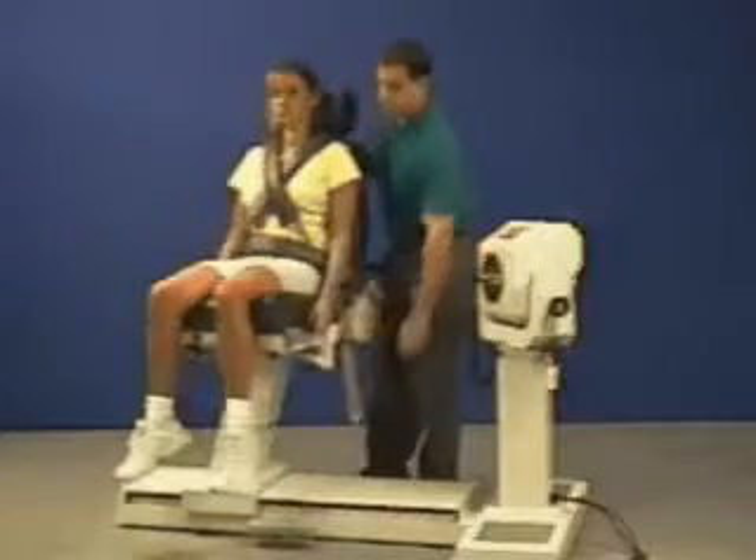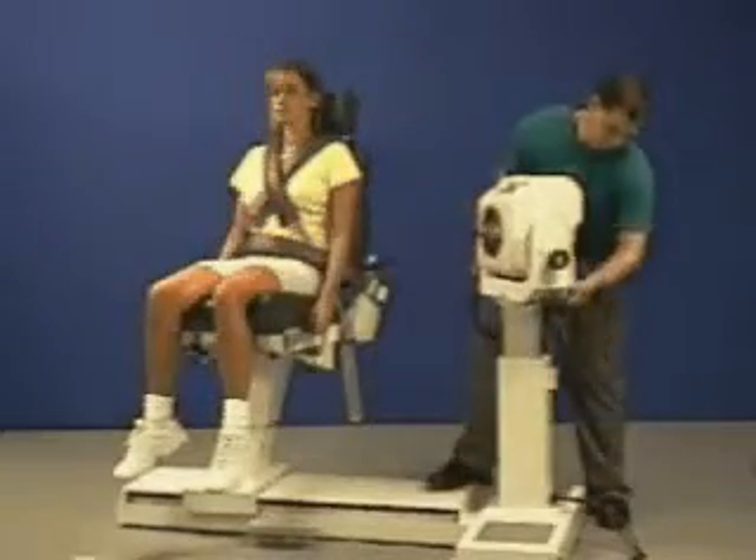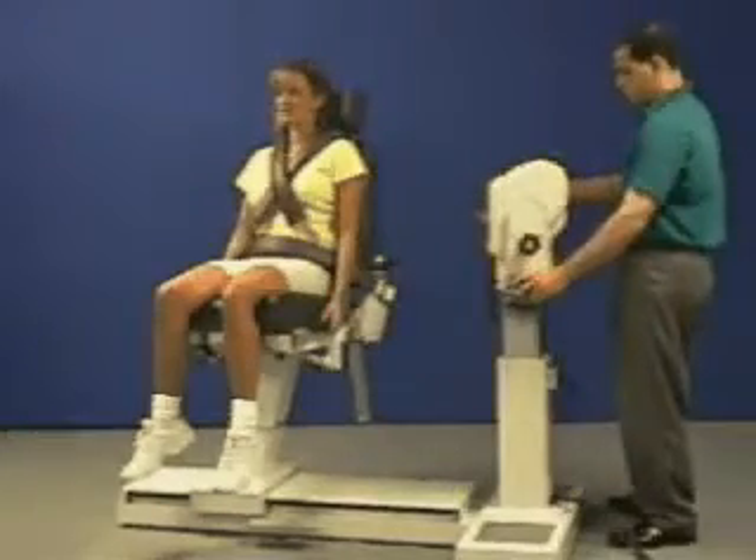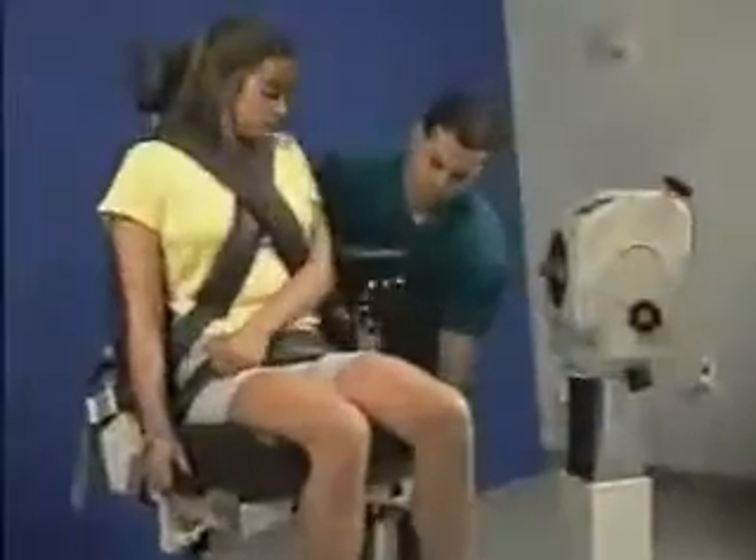Rotate chair to 15 degrees. Raise dynamometer to align axis of rotation and rotate 15 degrees. Install limb support.